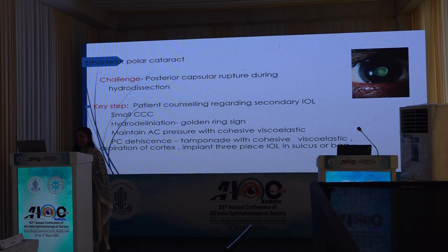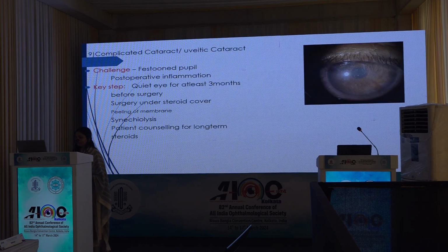In case of PC dehiscence, we should tamponade the PC with the cohesive viscoelastic, do dry aspiration of cortex, and then implant the three-piece IOL in the sulcus or in the bag. Complicated cataracts or uveitic cataracts: the challenge here is the festoon pupil and post-operative inflammation.